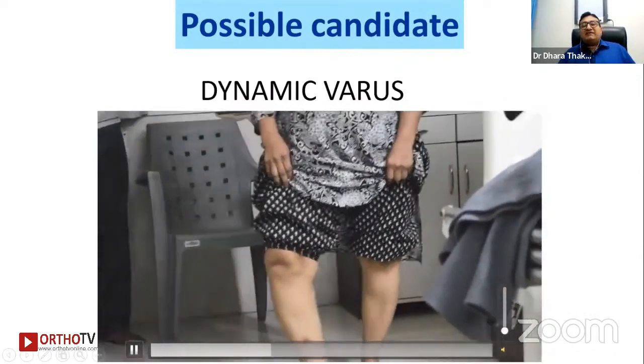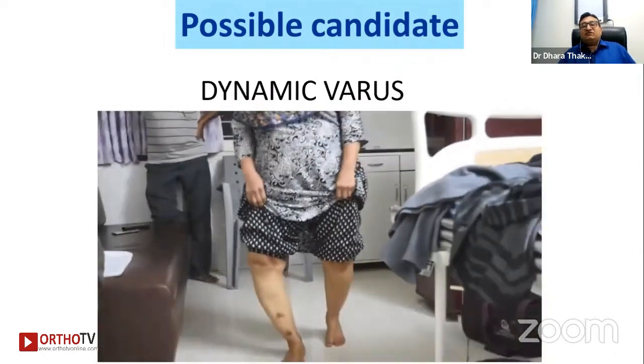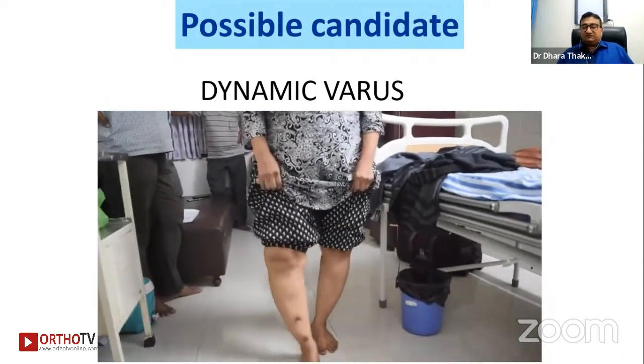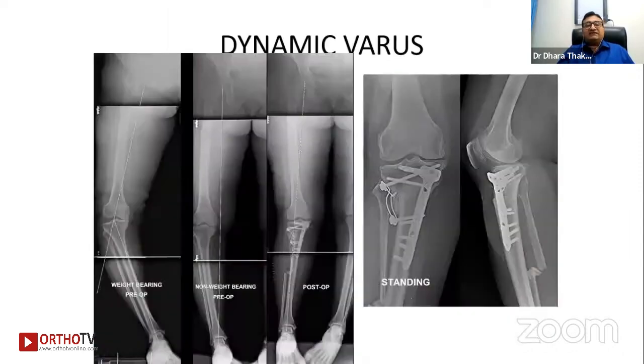So this is the dynamic varus. We can see that while she was bearing weight, the varus was increasing. So if we look at the X-ray, then on weight-bearing X-ray it was like this. There was a lot of opening on the lateral joint space. And if we take a non-weight-bearing X-ray, then it was like this. So we always calculate on a non-weight-bearing X-ray. And after surgery, it was corrected very nicely near the Fujisawa point.